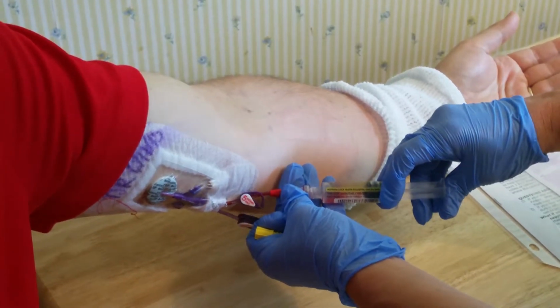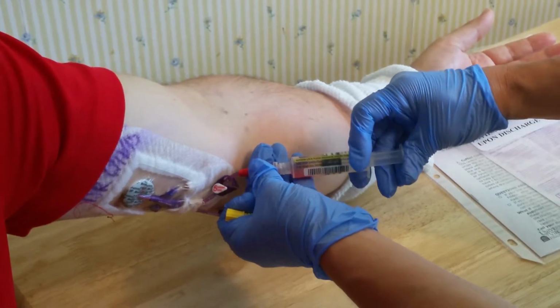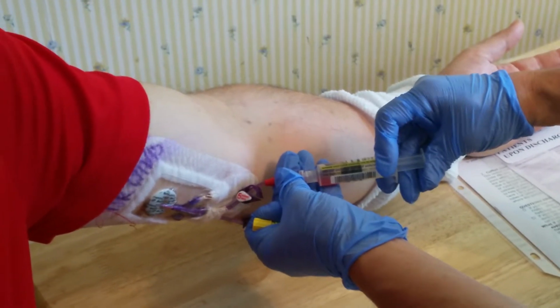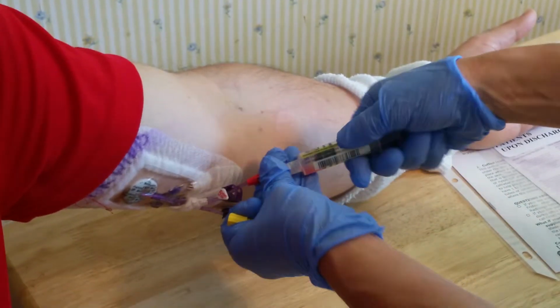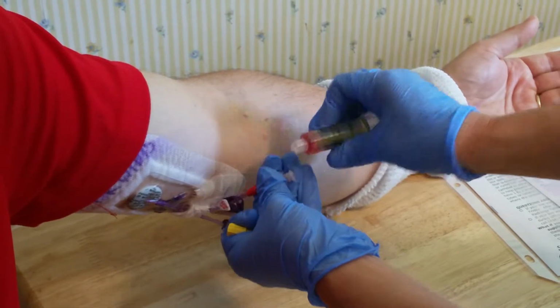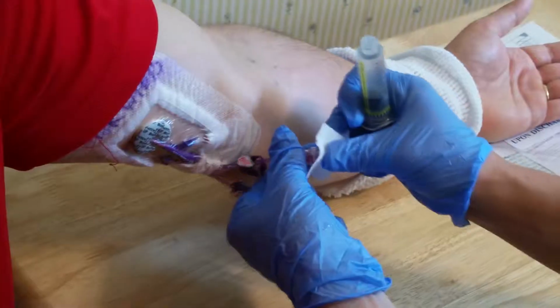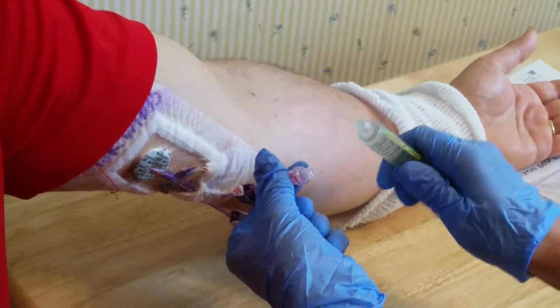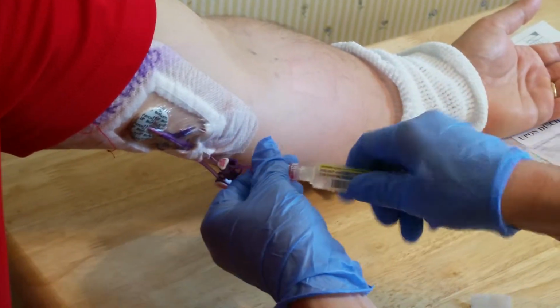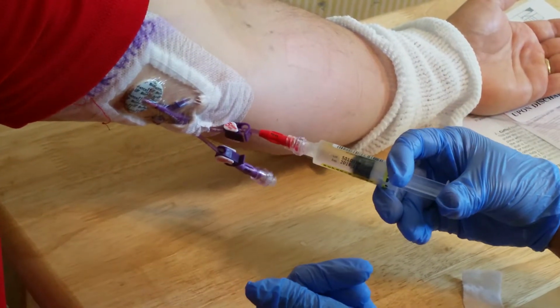Oh, okay. Why does that happen like that? It's where it's positioned inside. Oh, okay. Yeah, so even up here could have blood in it there. I'm going to get a new one because I don't want to have any blood in there. We want to make sure it's only heparin in there so that it won't clog. Okay. So new to the heparin. Working now? Flushing like a dream.